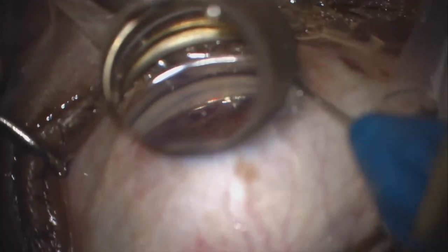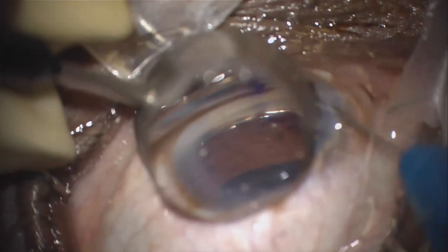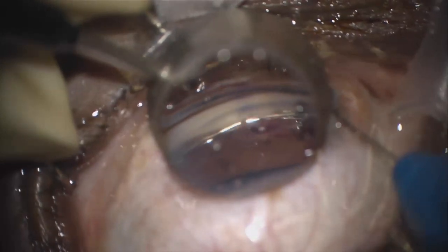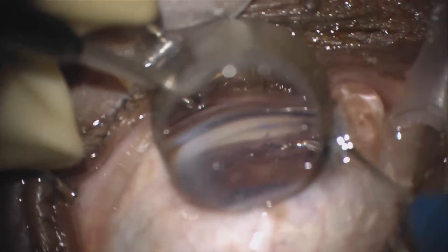Here is a case where after the initial insertion, it was seen that the Hydrus was not seated well in Schlemm's canal. The implant was retracted partially with the inserter but then got stuck in the process. It was decided to bring the implant and inserter out of the eye to place the Hydrus on the corneal surface for recapture.